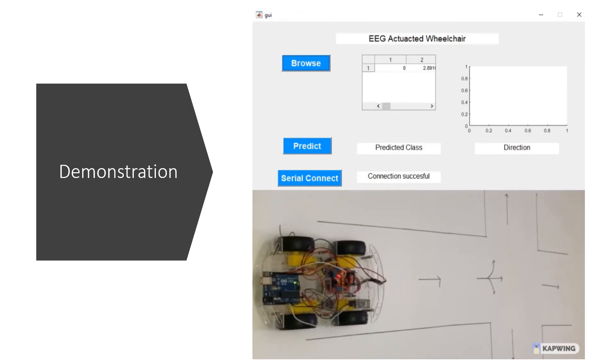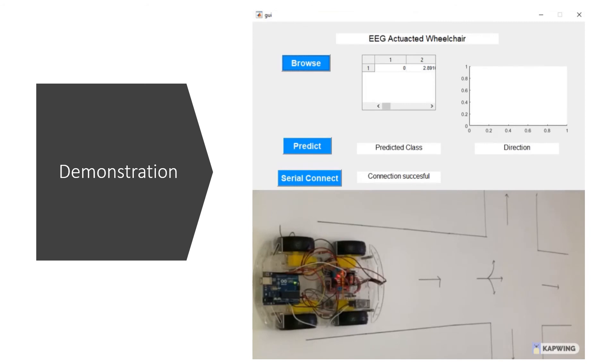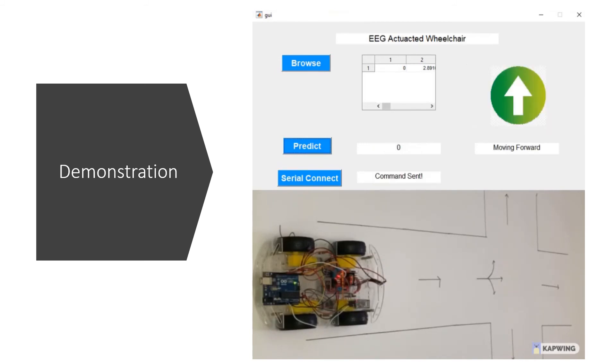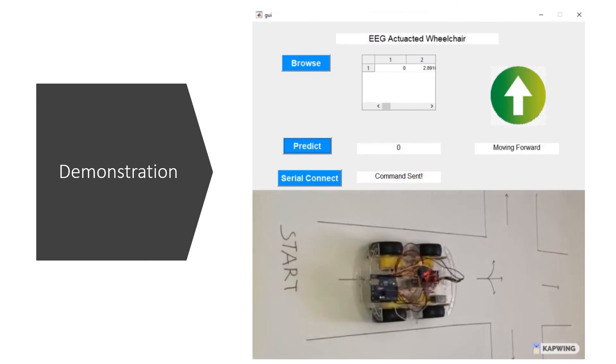Note that the first column of the data is actually the actual class of the input data but this column will not be used while predicting. After we predict, the predicted value will automatically be sent to the prototype wheelchair for actuation. After we got the value, then the data is sent and after the prototype actuates, the GUI will indicate the direction of the wheelchair as well.